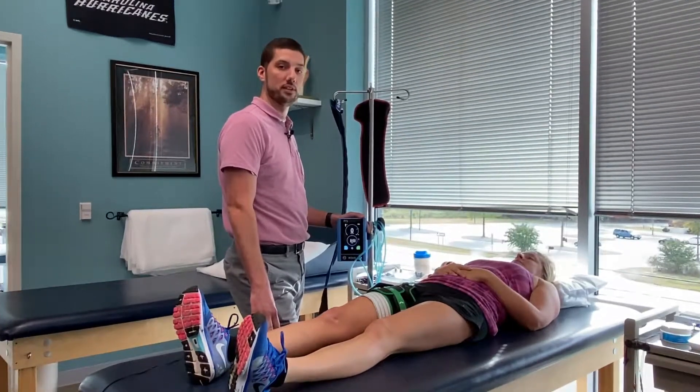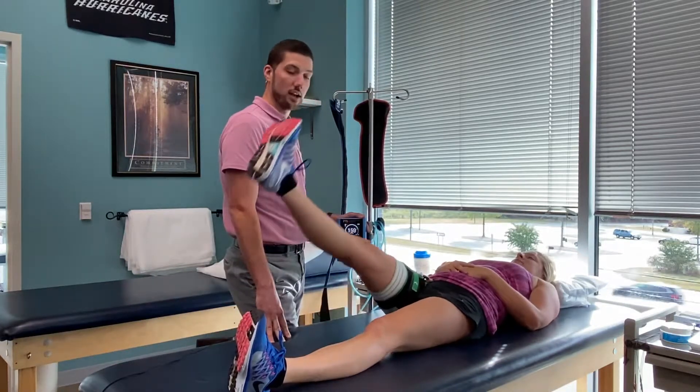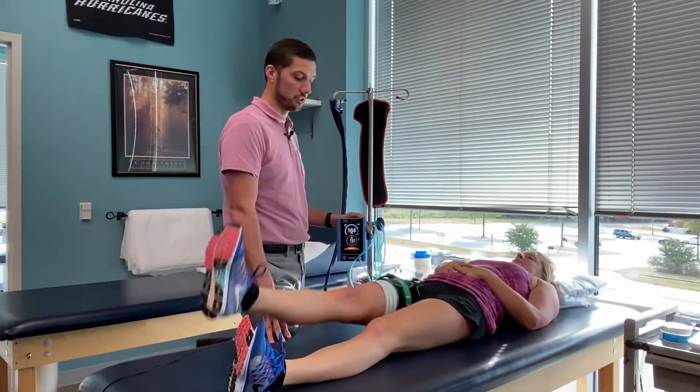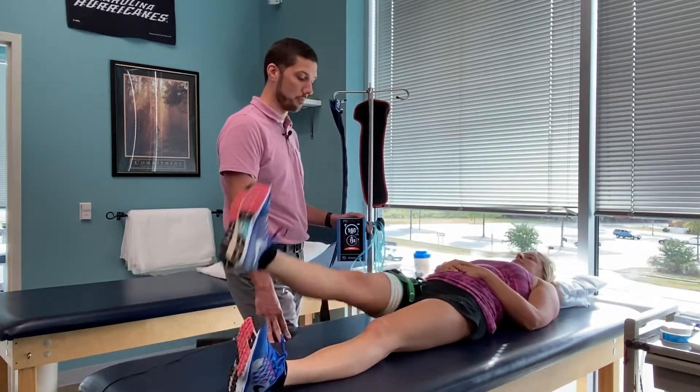Now we're going to go through an example of one of the exercises that can be performed. I'm going to go ahead and inflate the cuff, and we're going to have the patient start with the first set of 30 reps, and she will continue on through the remainder of that protocol.